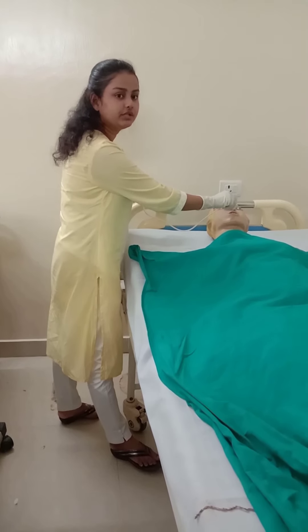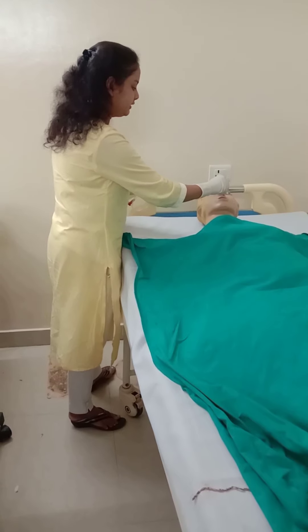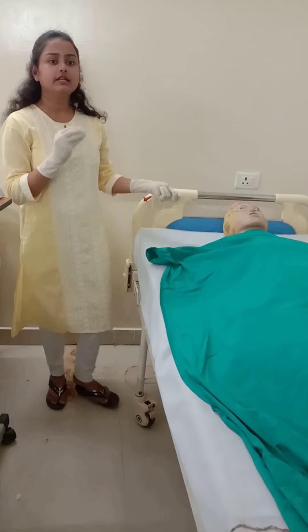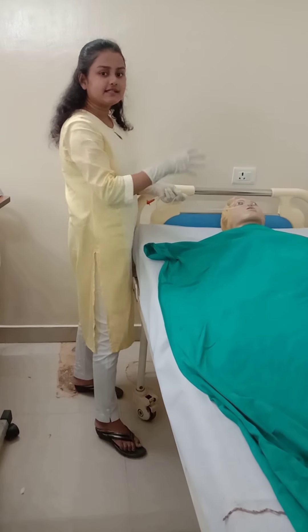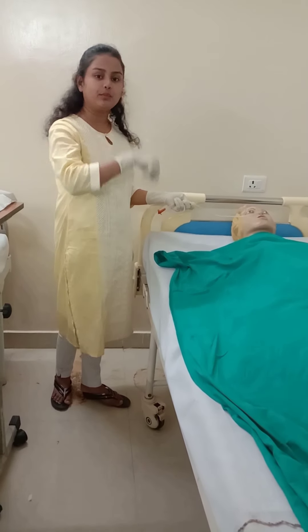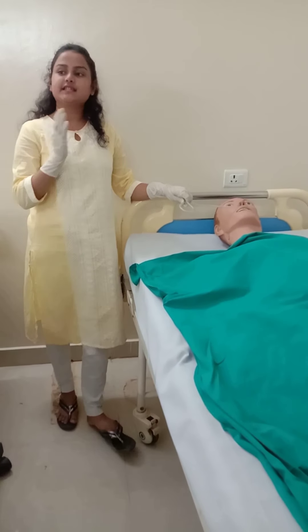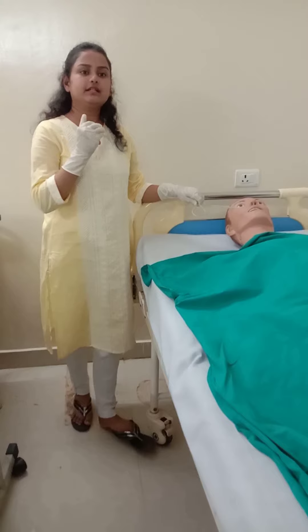Slowly insert the Ryle's tube — do not forcefully push it. Make sure that you insert up to the marked point, and always ensure that the tube does not coil inside the patient's mouth. When you have inserted at least half of the Ryle's tube, ask the patient to sip water, because when the patient sips water and initiates a swallowing reflex, the Ryle's tube can be inserted more easily.